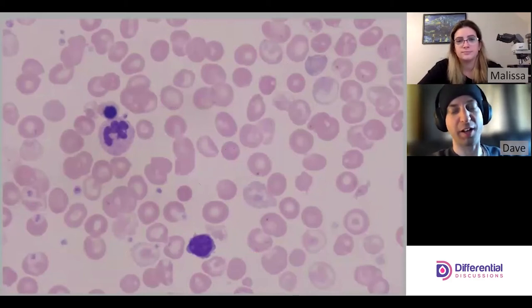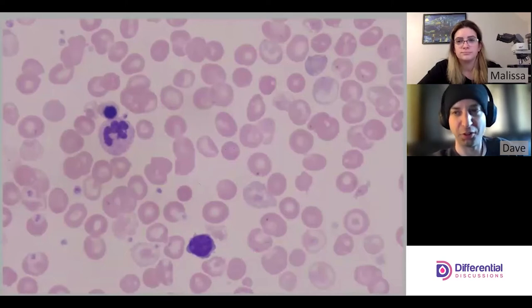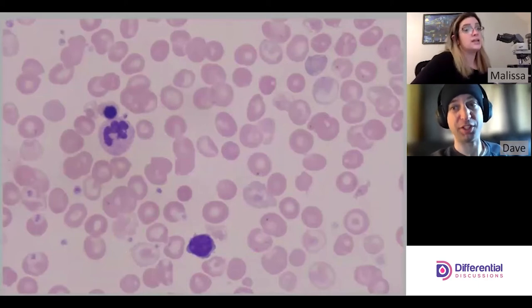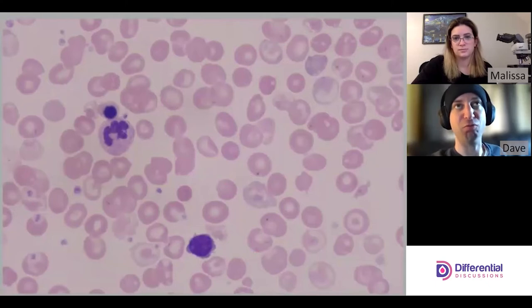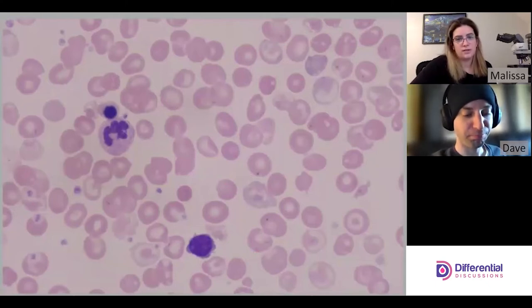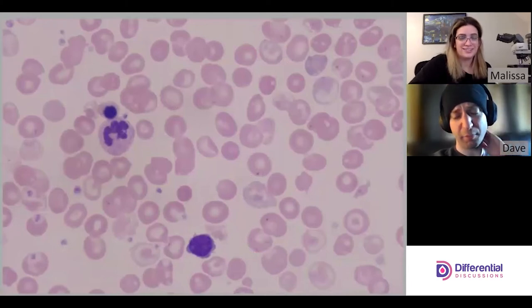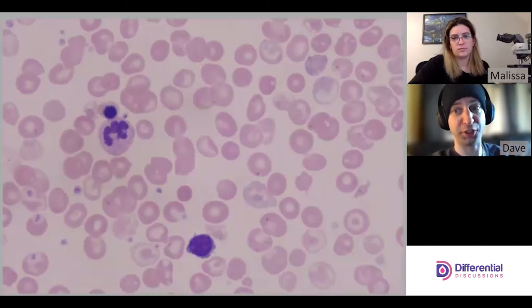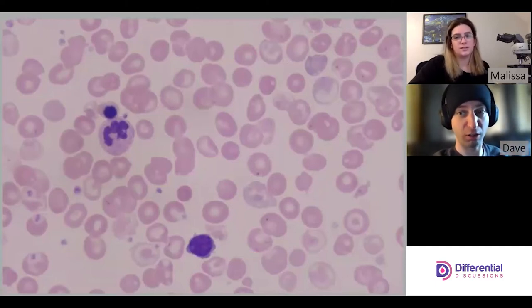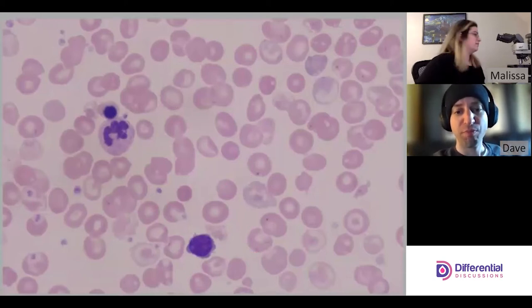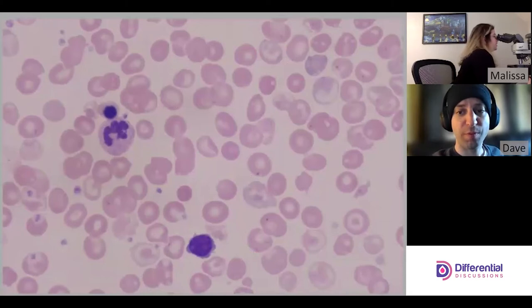Students often struggle with this distinction: acanthocytes have uneven projections while echinocytes have much more even projections. Acanthocytes also tend to have extreme projections — very long — whereas echinocyte projections tend to be shorter.